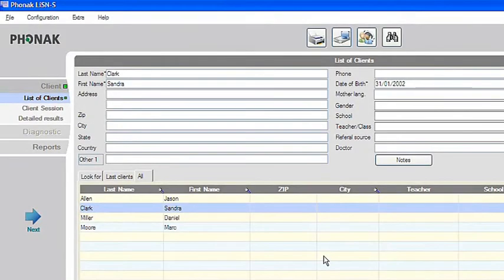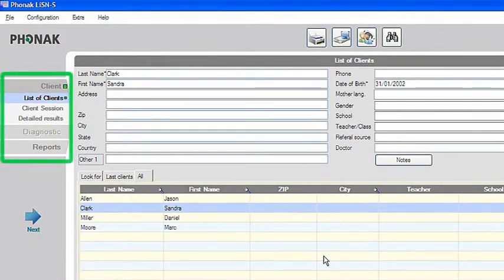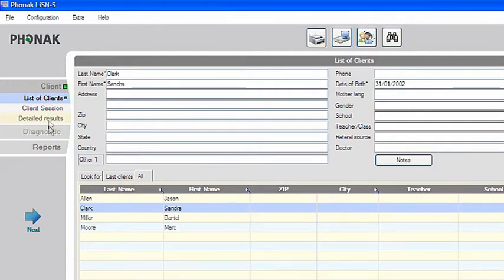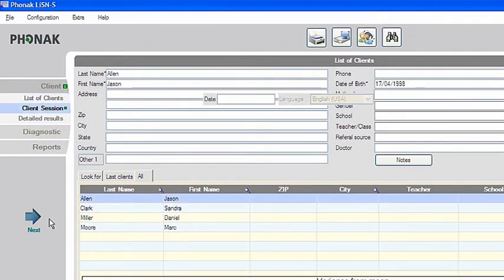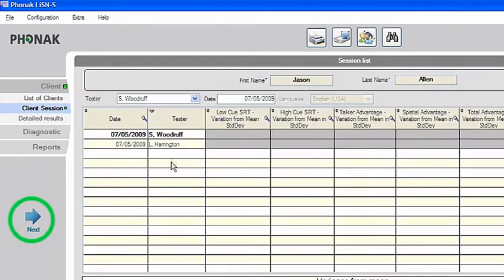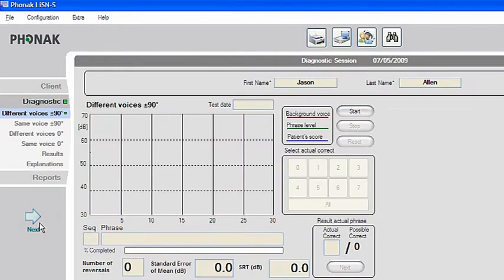The standard workflow when administering Listen S progresses vertically down the navigation bar on the left, from top to bottom. For easy navigation you can also click the big arrow on the left. This will take you to the next required step.